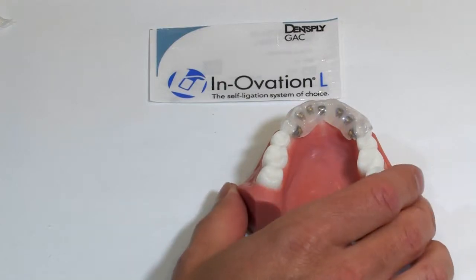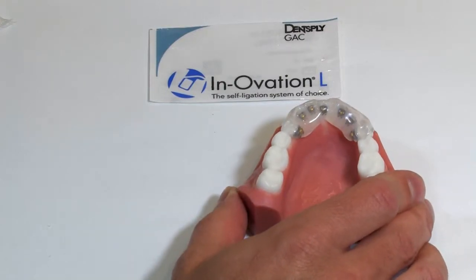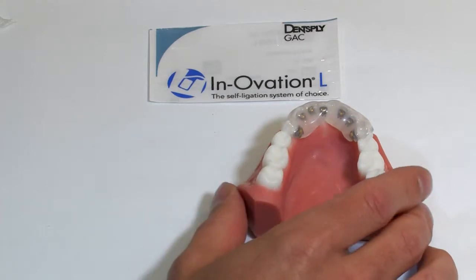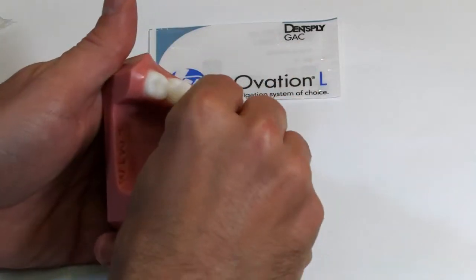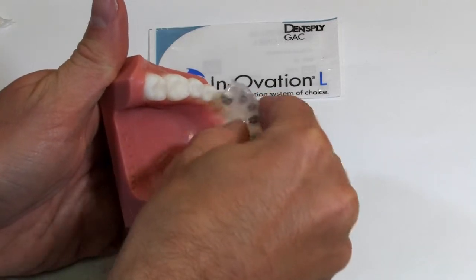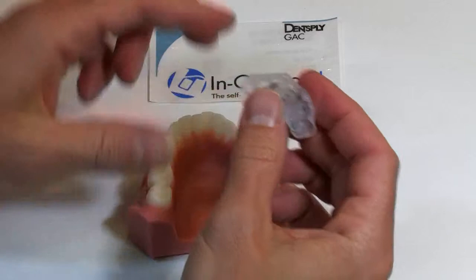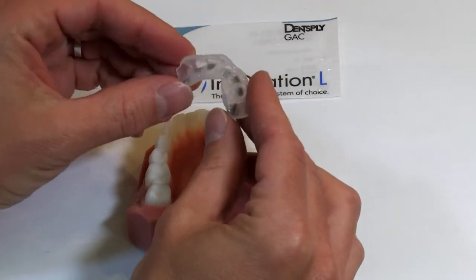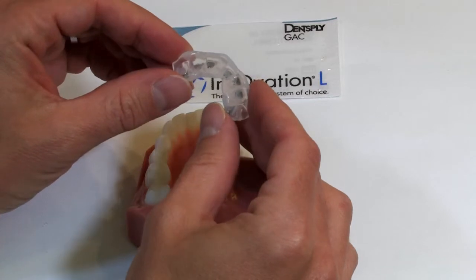Once you have the indirect bonding tray done, you'll soak it in a water bath for anywhere from 20 minutes to two hours. And then you should easily be able to go in and just peel this tray away from the stone model. And you can see now we have a bracket tray that has all of the brackets fully encapsulated, ready to go.